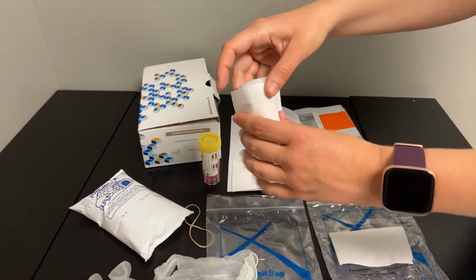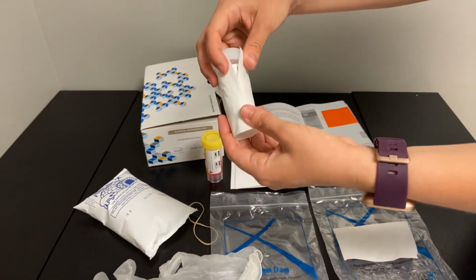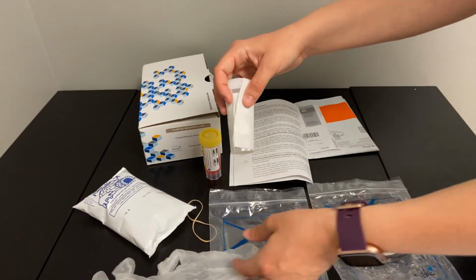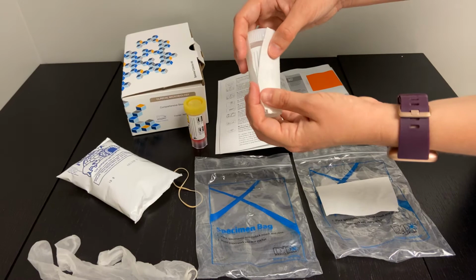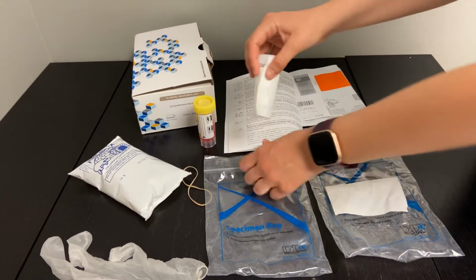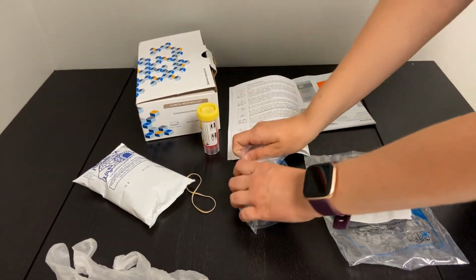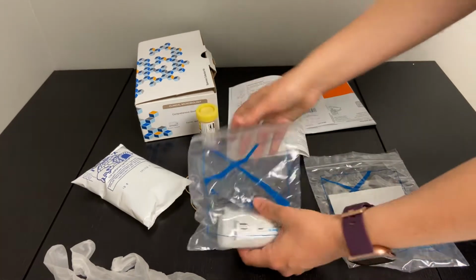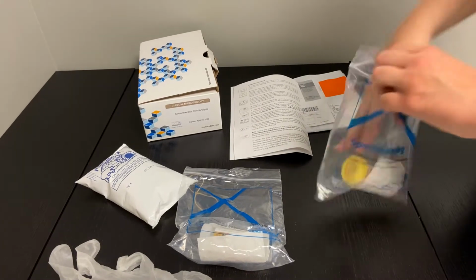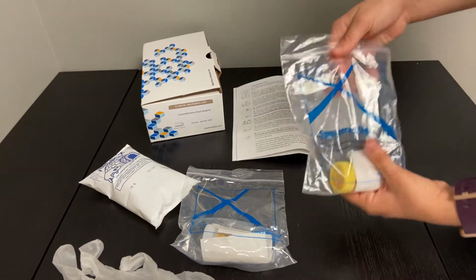There are 2 different specimen bags. This one here, we're gonna do the same thing for both, but I'll show you with this white one. We'll make sure to wrap with the paper towel that's included around this vial to potentially collect any sort of condensation that might leak out. We don't anticipate any of the fluid leaking out, so we need to make sure that's nice and twisted tight. It'll go into the specimen bag just like so. Make sure all that air is out of it. And then do the same exact thing here with this yellow one. Of course, making sure everything's labeled nice and clearly, and it's nice and twisted on tight.